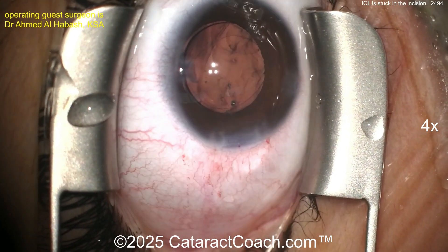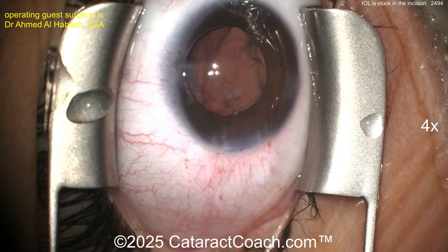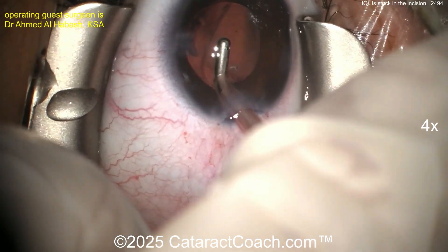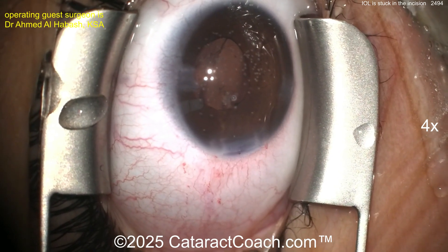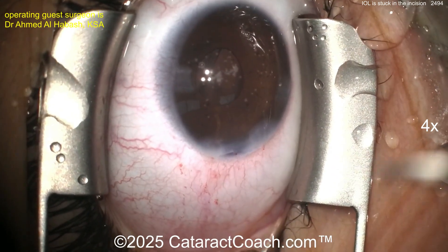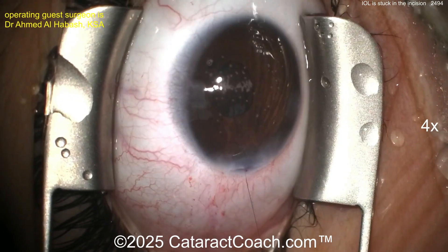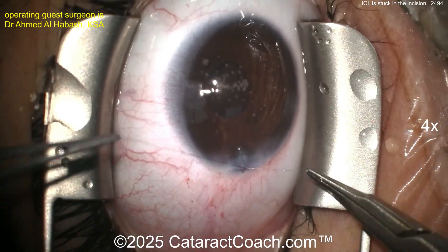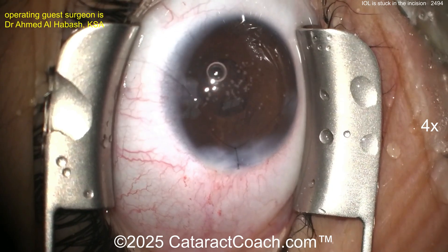That looks good — that's a nice outcome. I'd definitely put a suture in. Bringing down the pupil with Miochol is always a good idea. It helps hold the lens in place if it's purely sulcus, but this one's optic capture so you're safe. It also tells you there's no vitreous left in the anterior segment — if the pupil peaks, you know you need to do something different. Here goes hydrating the incision, now there's a suture — beautiful job. This patient can have a fantastic outcome.